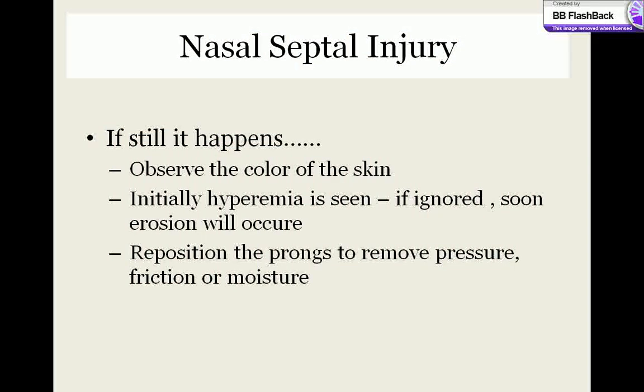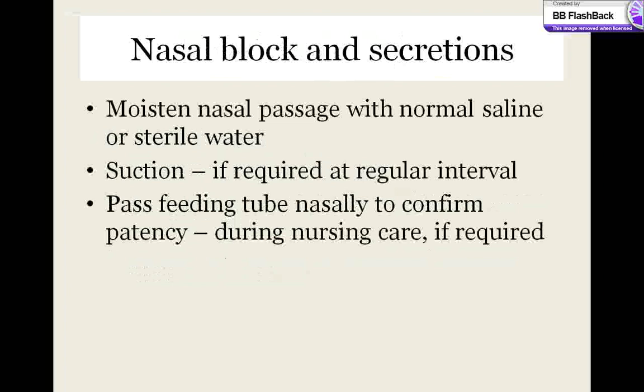Observe the skin over nasal septal area every 30 to 60 minutes for any change in color. At the first sign of hyperemia, prongs need to be repositioned, otherwise it leads to bad erosions. Normal saline or sterile water needs to be instilled at each nursing care. Ensure patency. If required, it should be suctioned at regular intervals.